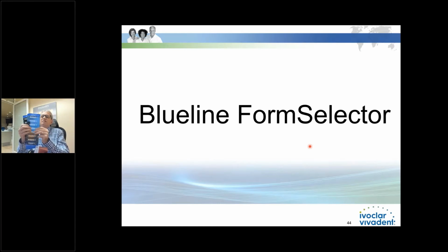And as you can tell, I have medium, soft, and bold. Now, what's really nice, the way I like this, if you look really closely, the first one here is 49. The next one is 51, 49 and a half, 50 and a half, 49 and a half, 50 and a half, 51. All of these were within 1 to 2 millimeters from the other one.